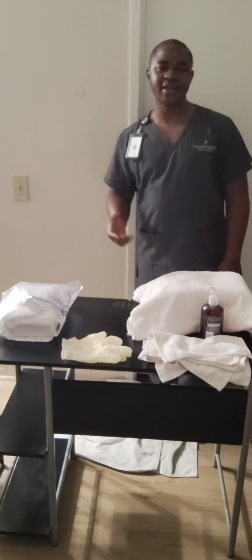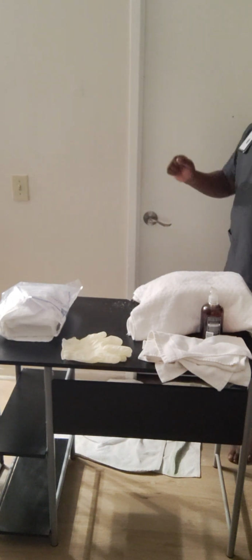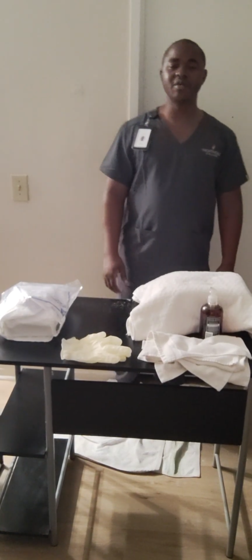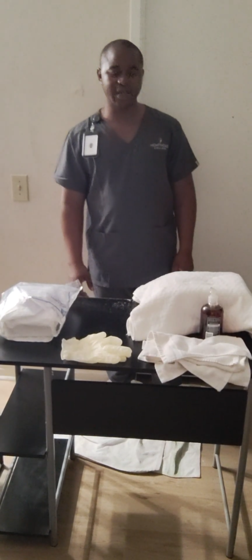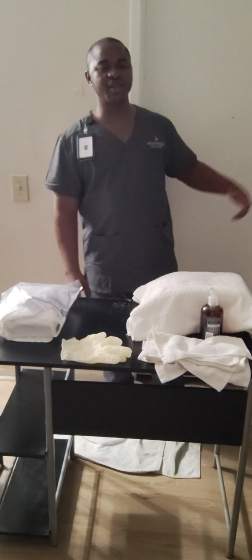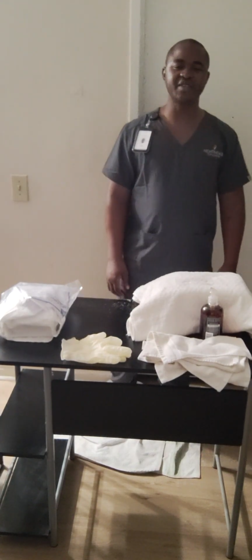What I do is I get in the patient's room, knock, knock, knock, patient lets me in. I introduce myself. Hello, my name is Penda Boma, I'm going to be your nurse for the day. And then I close the curtain to provide patient privacy.